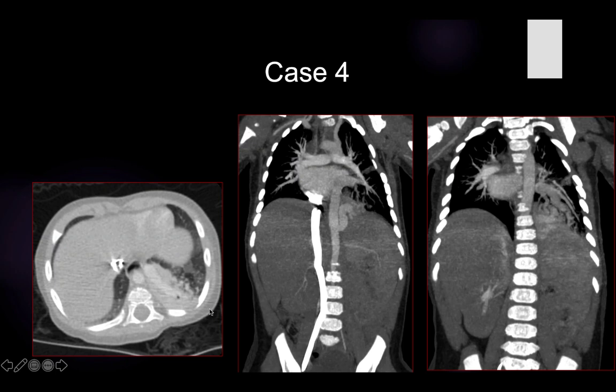Once you see an area of consolidation or a mass lesion that is supplied by a branch from the abdominal aorta or from the aorta, you should say this is a pulmonary sequestration. You diagnose pulmonary sequestration once you see a consolidation or mass in the lungs that is supplied by a branch from the aorta. This is a pulmonary sequestration.